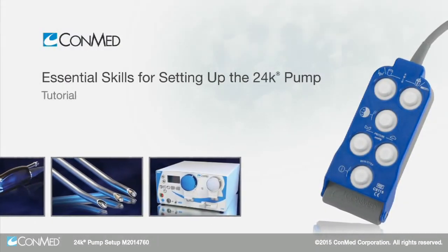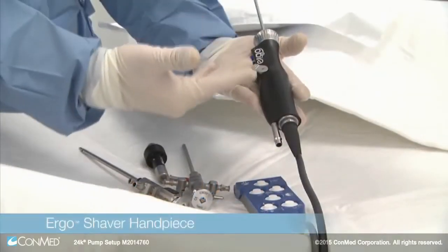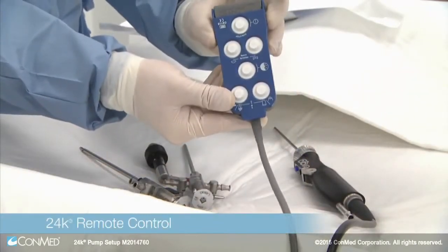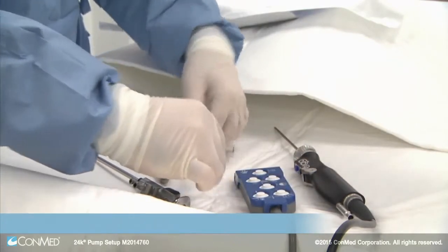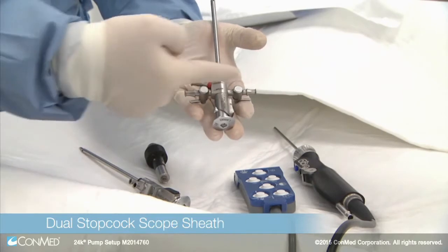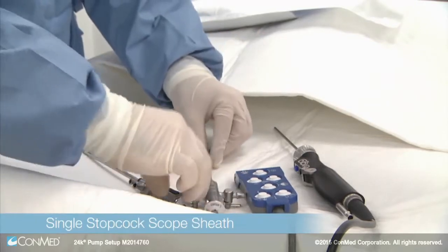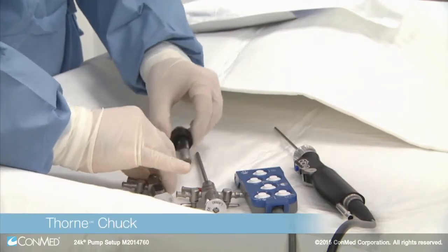To begin setup, be sure to have the following instrumentation ready: the Ergo shaver handpiece, the blue 24K pump remote with multi-function buttons for ease of use and pressure sensing, scope sheaths. The dual stopcock scope sheath has inflow, outflow, and pressure sensing ports. The single stopcock scope sheath has two ports: inflow and pressure sensing.